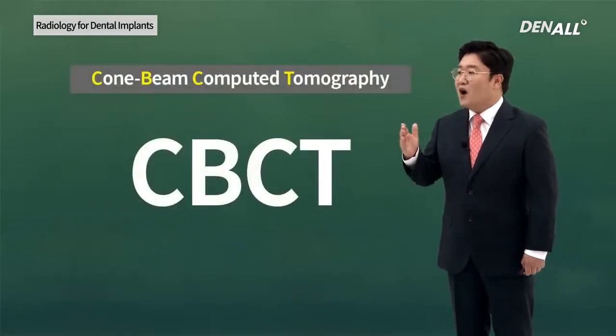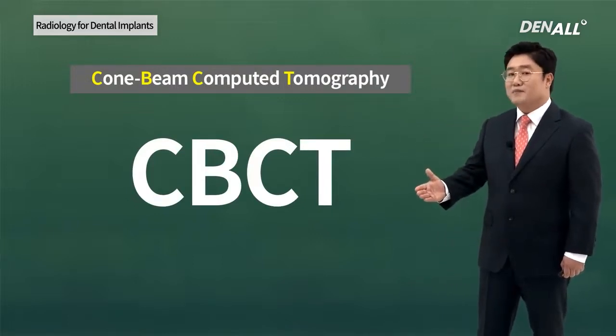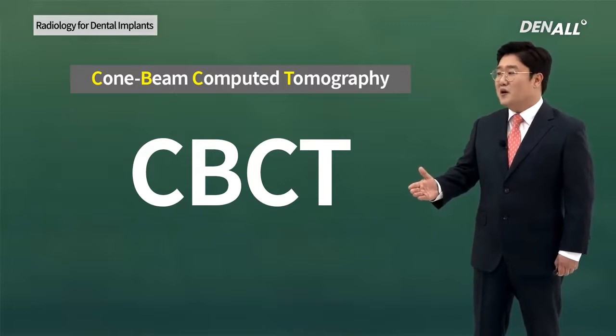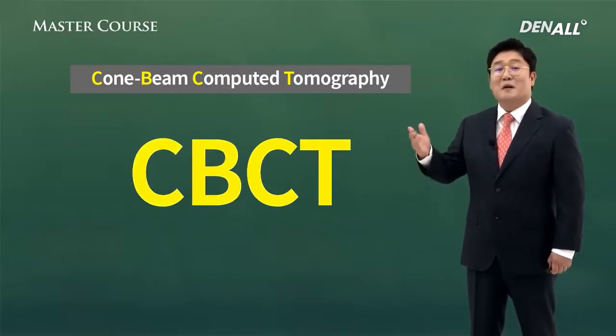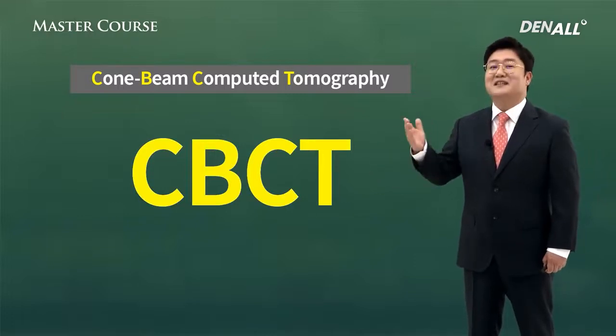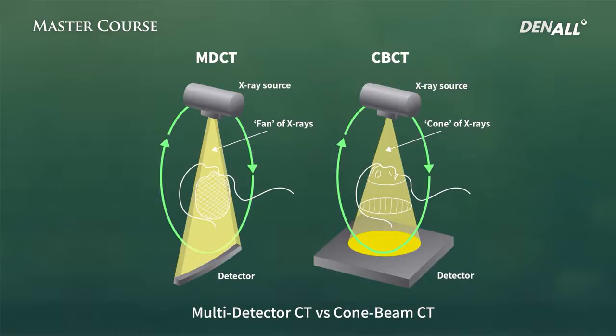First, cone beam computed tomography. It is abbreviated to CBCT. The imaging equipment or the images. Let's compare it to the conventional CT.